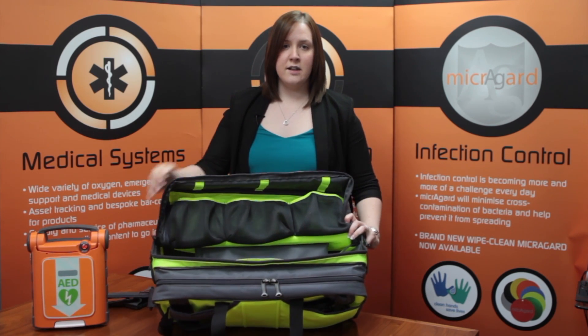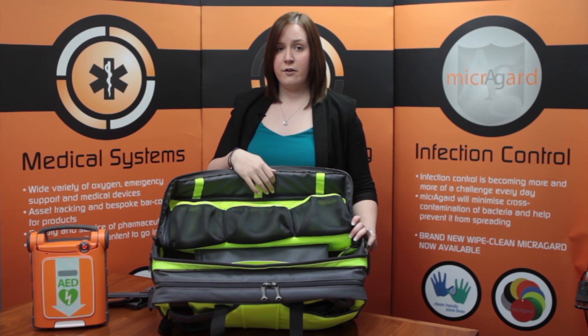In the fold-down section there are three large elasticated pockets, perfectly sized for storing BVMs, and above there are elastic loops for extra storage.